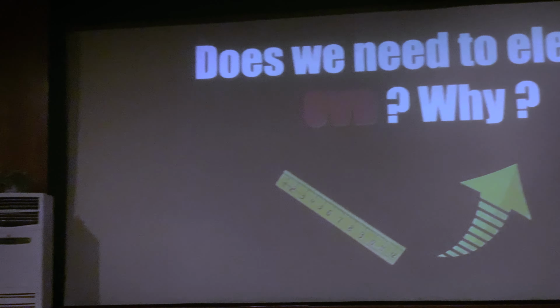And why? The answer is, in this slide, we can see the deep bite. We already said that it was 5 millimeters overbite. Also, there is no incisor show, and in the posterior area there is not enough space for the prosthetic part and for the implant. And for the over-erupted premolars, if we need to make a positive smile line, we need to cut too much from the tooth structure. So we decided to open the bite.